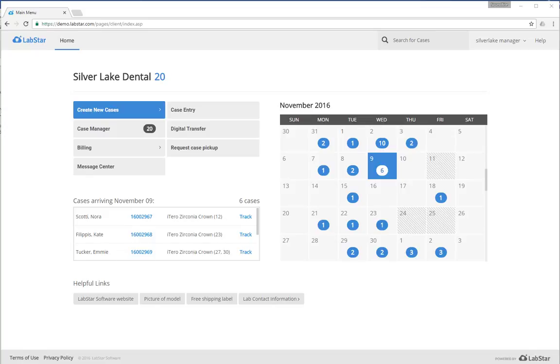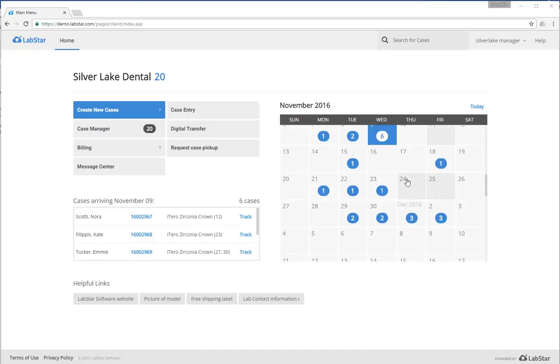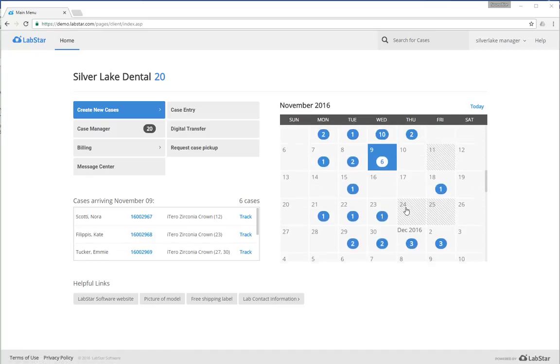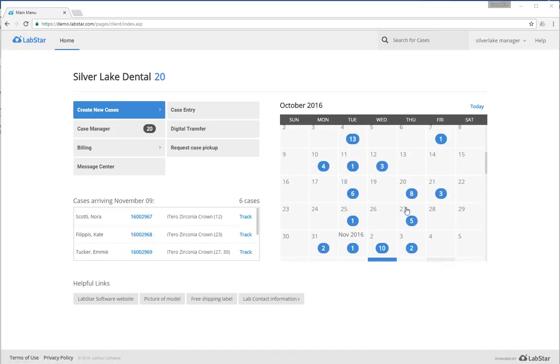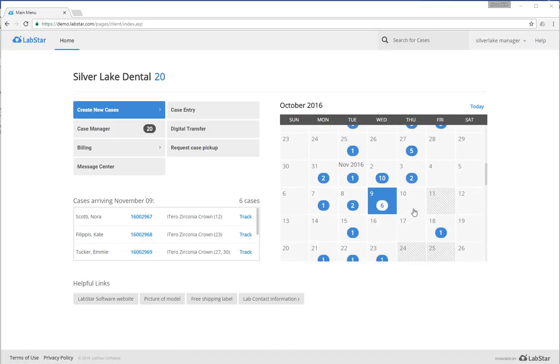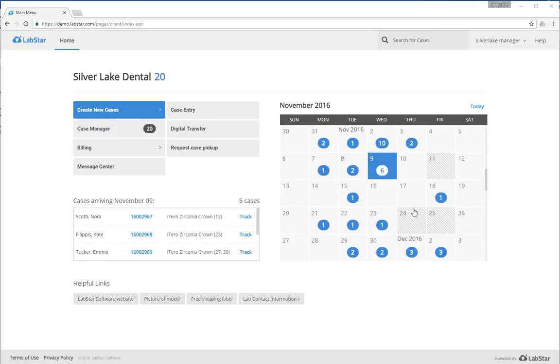You can see at the top left in your personalized dashboard how many cases are currently in the lab itself. When they're delivered back to you is always shown on this calendar, which you can move through forwards and backwards to see when cases have come in.